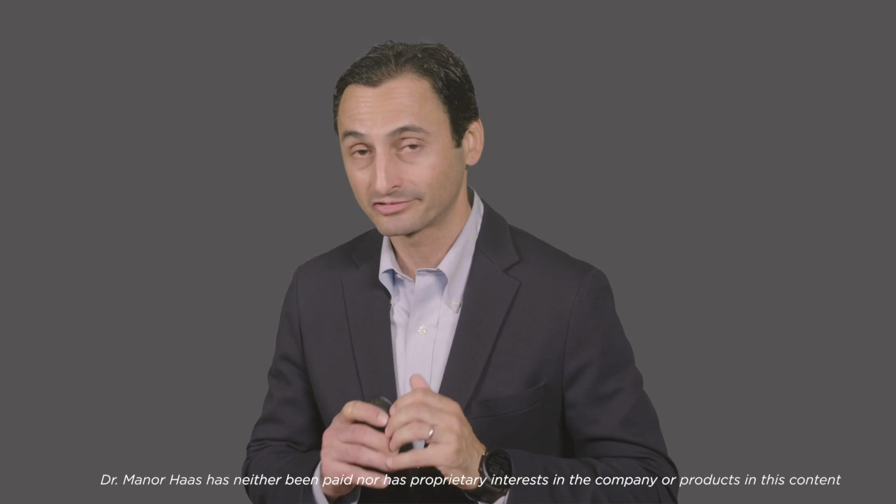So what do we do? Well, my tip for this is quite simple, and it's nothing new, but you've got to have good working length. It is so important to have proper working length. It is such a fundamental part of endodontics that I feel we don't even talk about it enough. But that's one of the best ways to avoid having issues and stuff going out the apex.